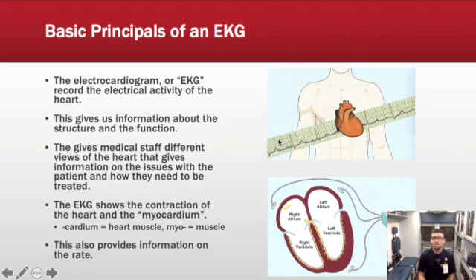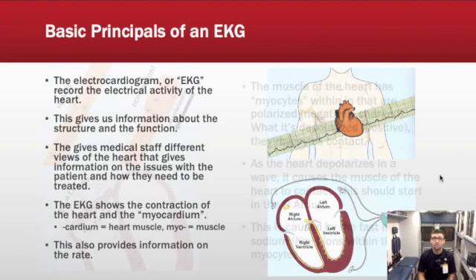And the EKG shows the contraction of the heart and the myocardium. The myocardium is the heart muscle, and this also provides us information on rate, or how fast the heart is actually beating.